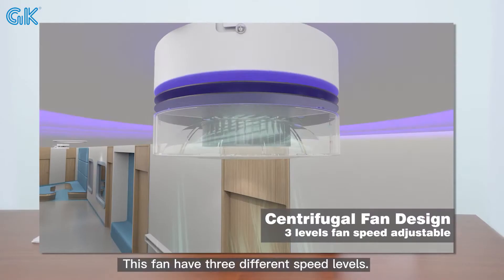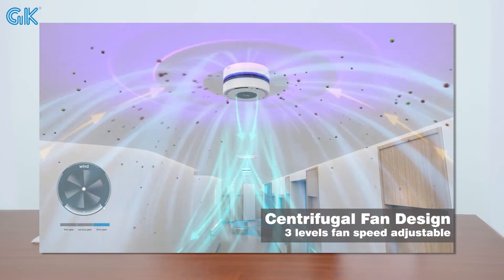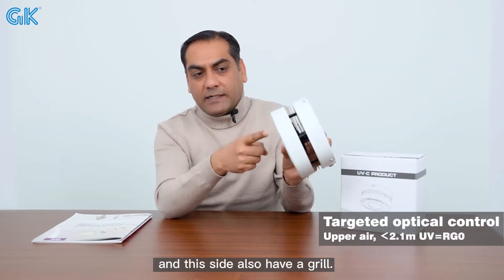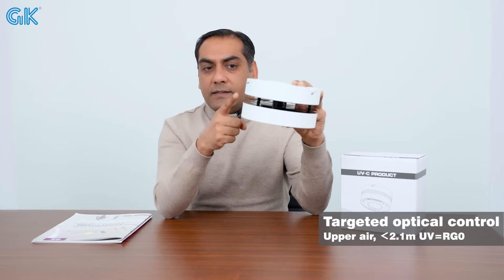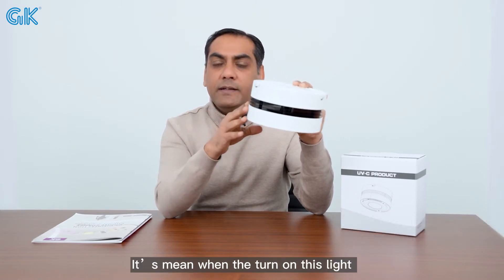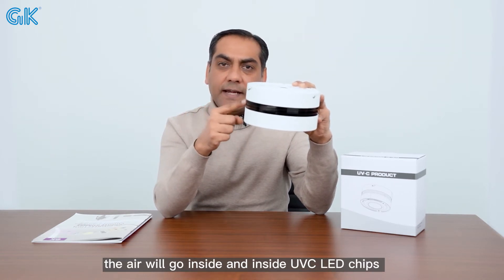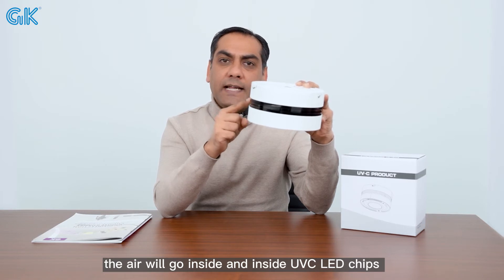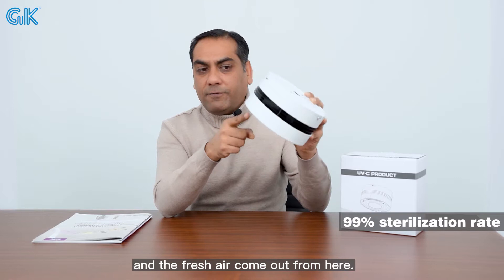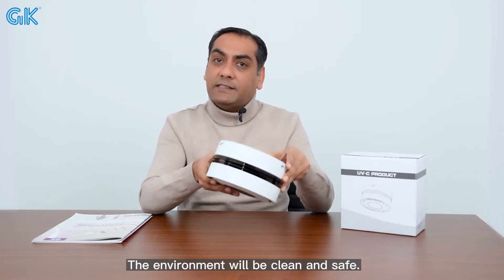This device also uses a fan with three different speed levels: 35 dB, 40 dB, and 45 dB. You can see the device has a grill that inhales the air and another grill that exhales. When turned on, air goes inside where the UVC LED chips eliminate viruses, bacteria, and mites.